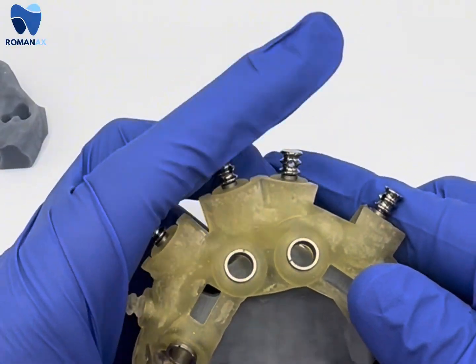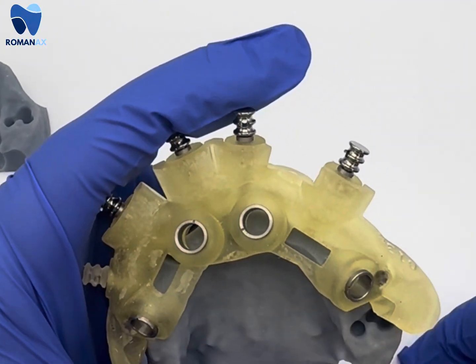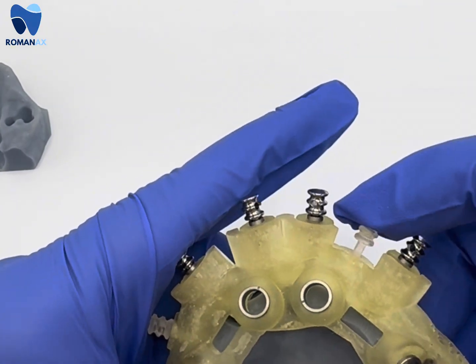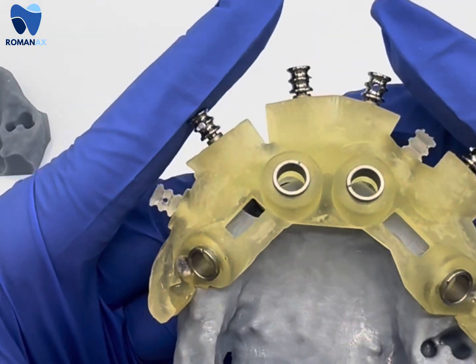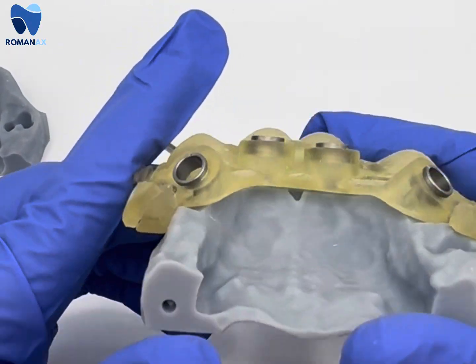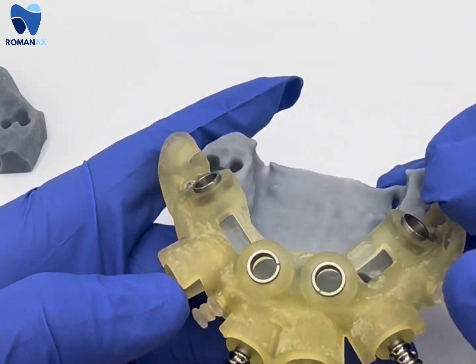Here we have the guide pins going into the osteotomy guide. We have two guide pins that get inserted to lock the guide in place with the bone reduction guide in place as well. This allows a nice intimate fit and it locks in place for stability purposes. The doctor would perform the osteotomy at this time.